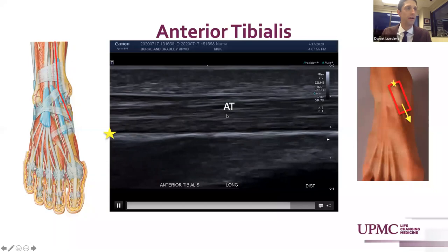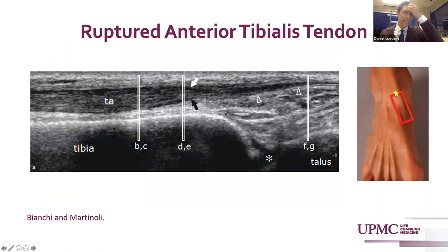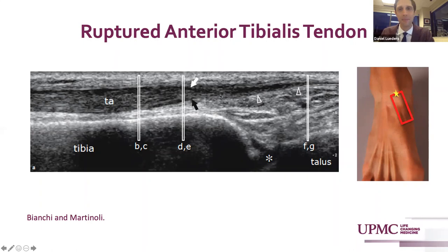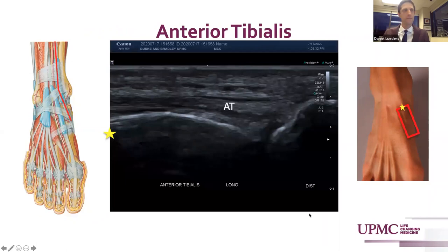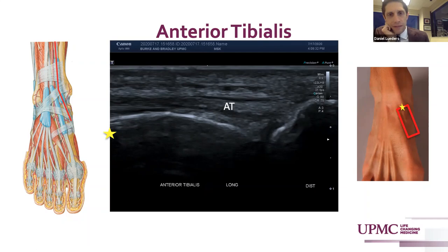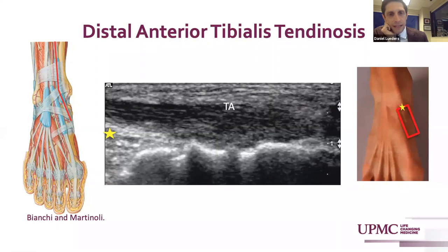This tendon looks rather even and normal in appearance. As with any long cylindrical tendon, it can be prone to rupture. In this panoramic view we see the distal tibialis anterior tendon intact over the tibia, but as we get to the ankle mortise, that tapers to just a wisp of a hypoechoic tendon, likely indicating a full thickness disruption. Care must be taken to follow the tibialis anterior all the way to its particular insertion onto the medial surface of the medial cuneiform and the base of the plantar first metatarsal. Tendinosis can be present here, manifested by a loss of normal laminar internal echo texture and bulbous thickening at the insertion.